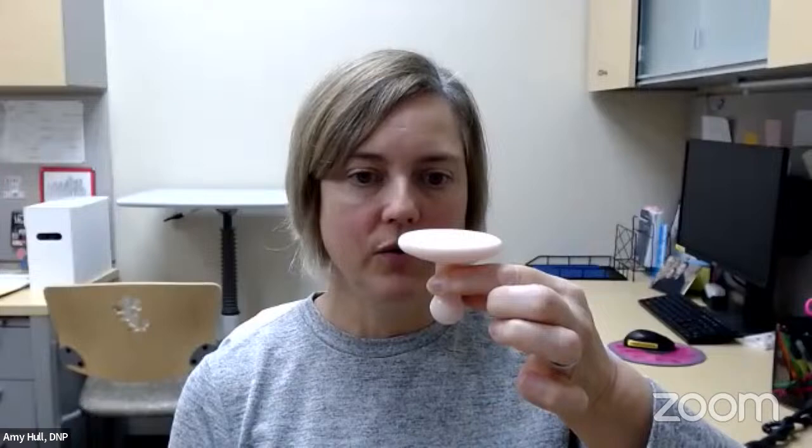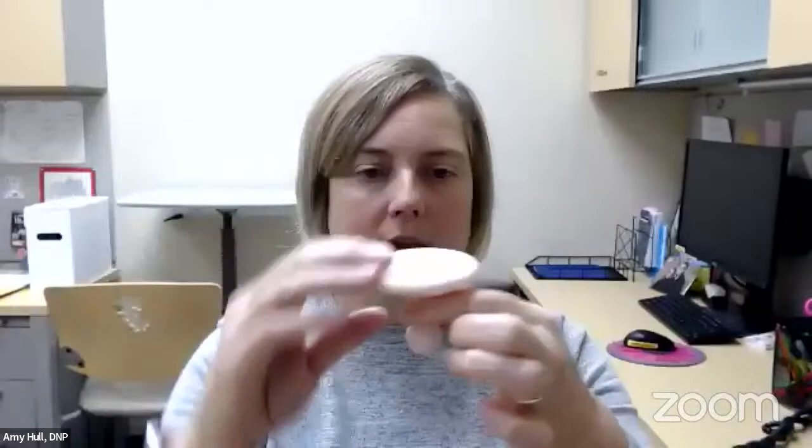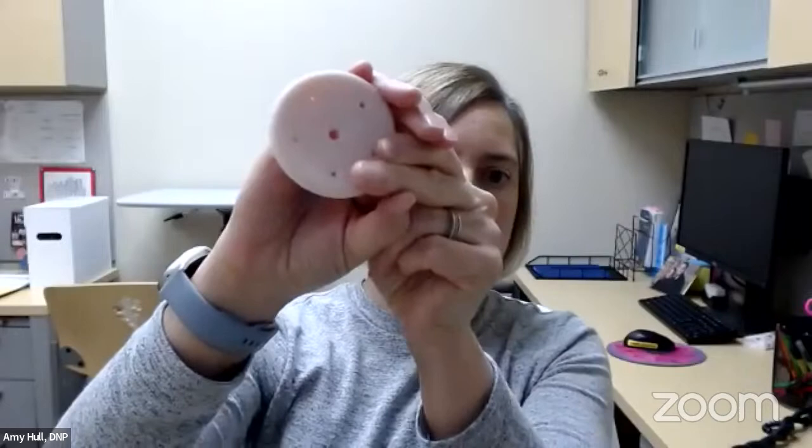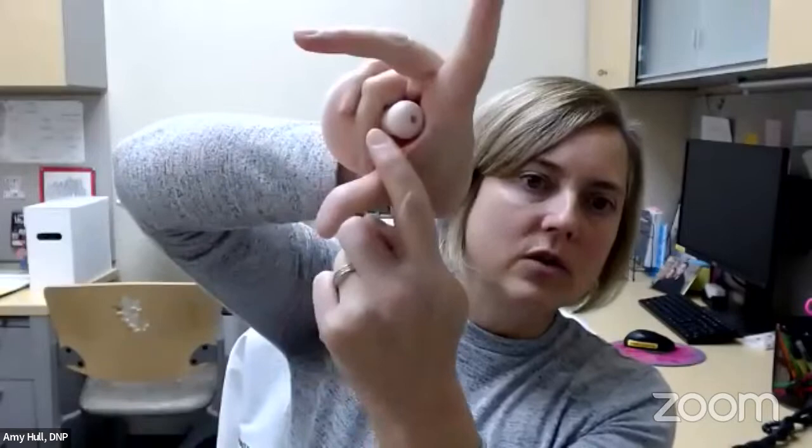So if the bulge is really big and it's out, I might have the patient just put the pessary up against the bulge and go in that way. If it's not that big or it's not out and they can't go in like this, I teach them how to turn that pessary on the side, and go in the vagina with that pessary on the side. So essentially we're going in as deep as we can. And then it typically wants to self-seat. It wants to pop into place. And then we just grab it and push it by the knob deeper into the vagina.